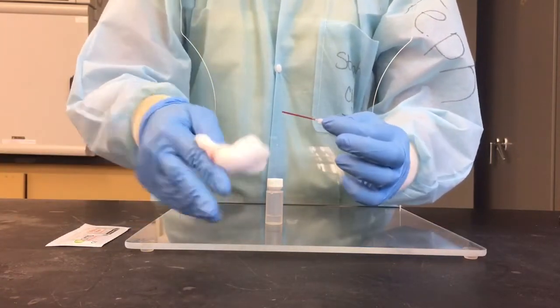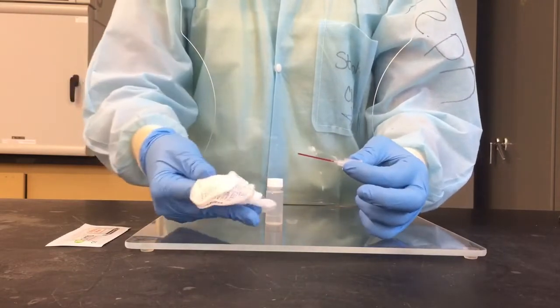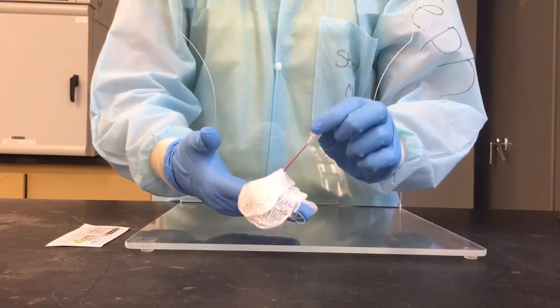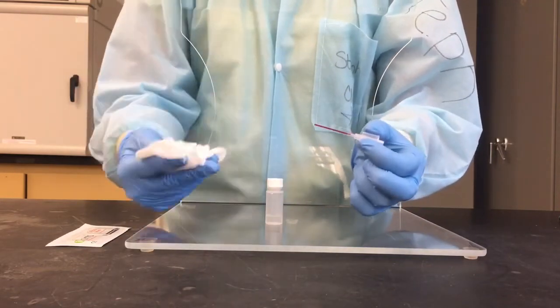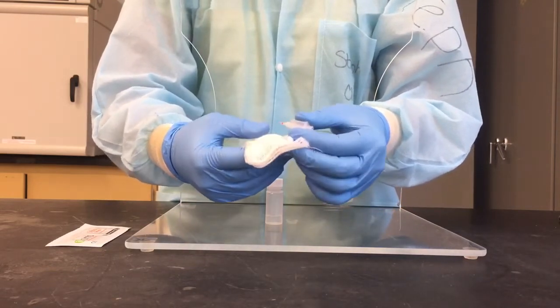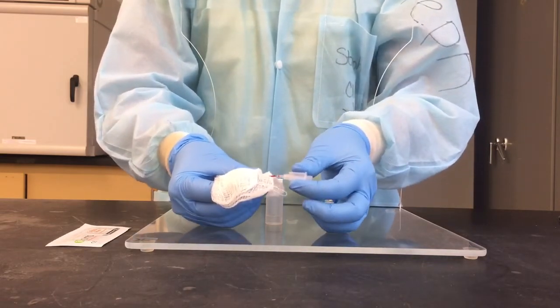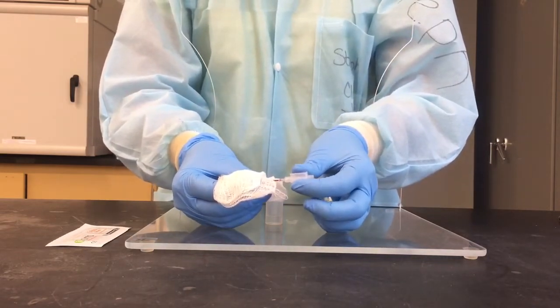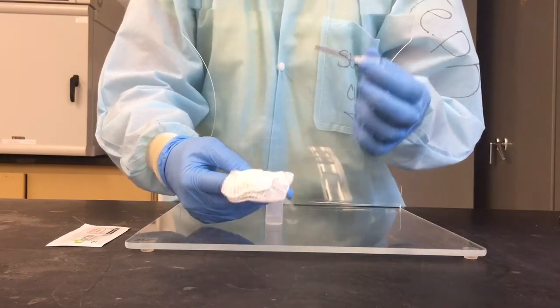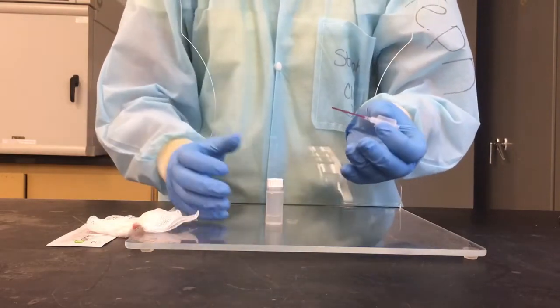And then take a piece of gauze, and you want to just gently wipe the outside of that capillary tube. Be careful not to touch the end, because if you touch the end, you will suck some of the specimen back out again, and then you will have an inaccurate specimen. If you do what I just did and you pull your capillary tube out, all you need to do, with steady hands, there we go, is just shove it right back in again. They are a little bit loose in these assemblies, but you can just shove it back in and it won't do any harm to your procedure.